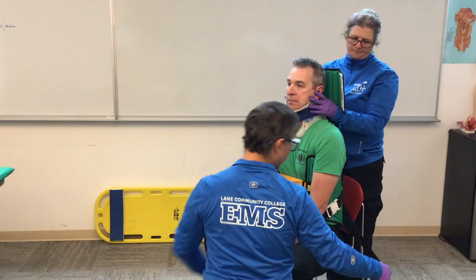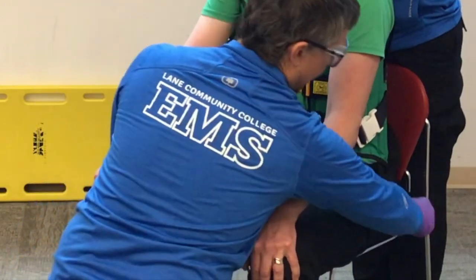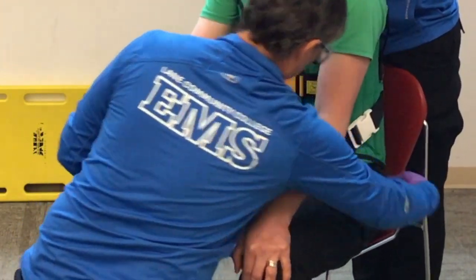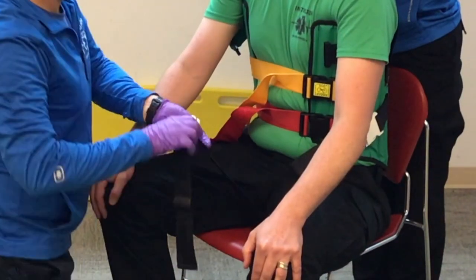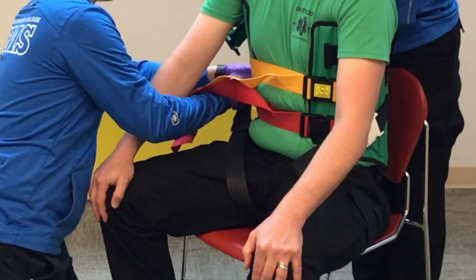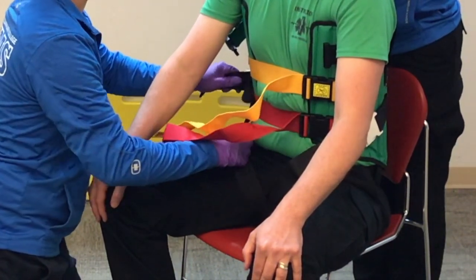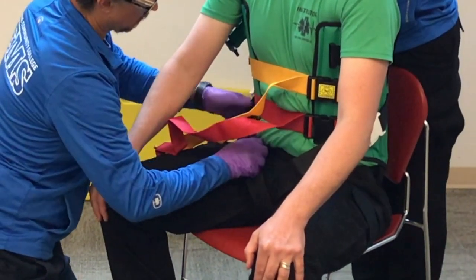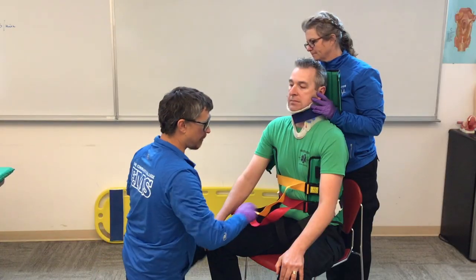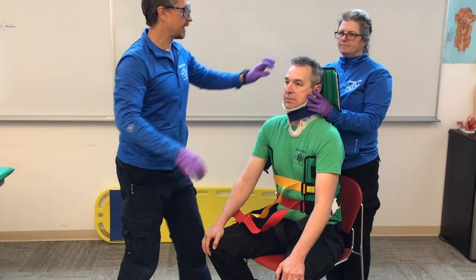Now I'll do the patient's left leg — slide the strap underneath the thigh, flossing it back and forth. I ask Chandler if he needs to adjust anything before I tighten. Once he confirms nothing is pinching, I tighten the leg straps. Now I have legs, middle, and bottom secured.